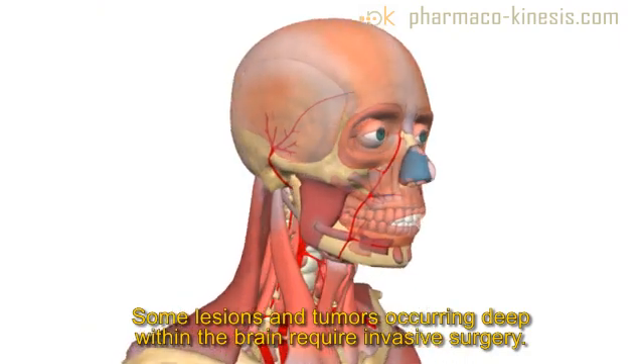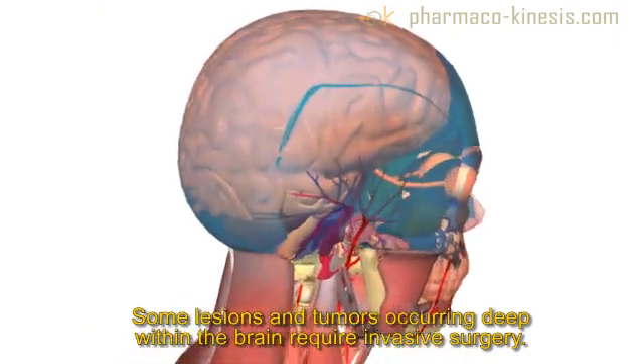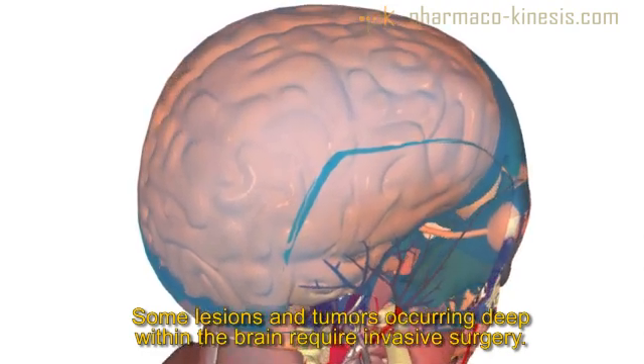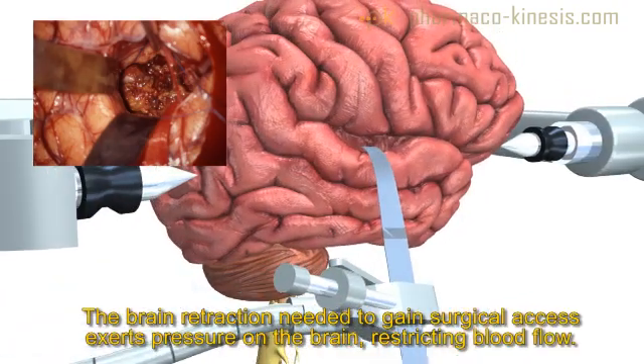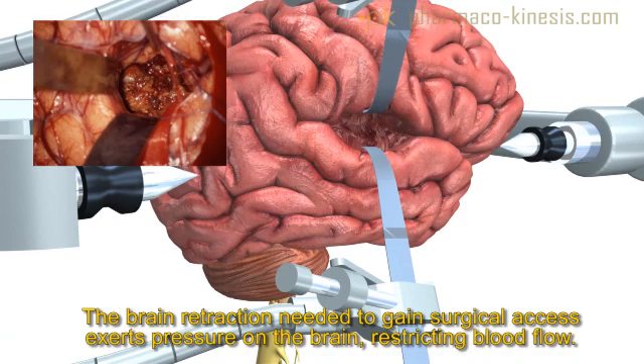Intracranial operations, such as those involving vascular malformations, aneurysms, and certain tumors, require intraoperative retraction of the brain to obtain surgical access to deeper regions of interest where such lesions form. This brain retraction is needed to gain exposure, but pressure exerted on the sensitive brain tissue results in locally restricted blood flow, and eventually permanent tissue damage can occur.